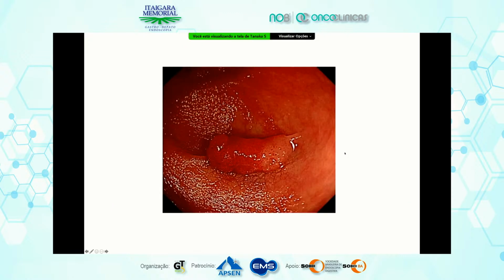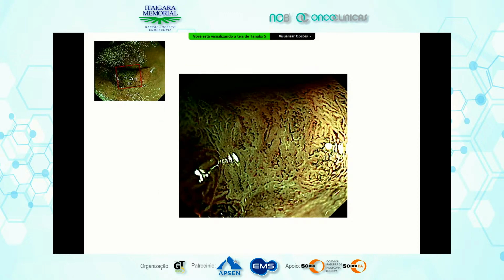Next. This is NBI magnifying view. Please vote.